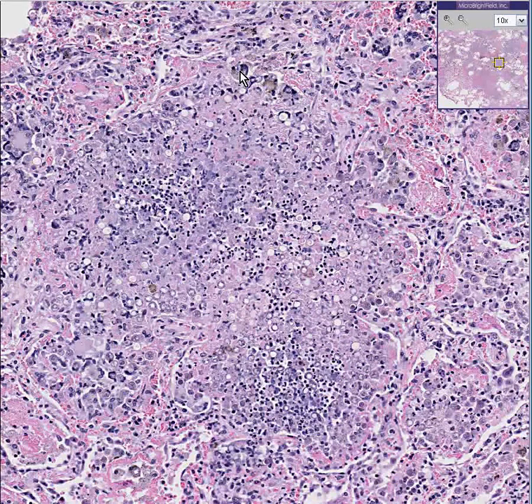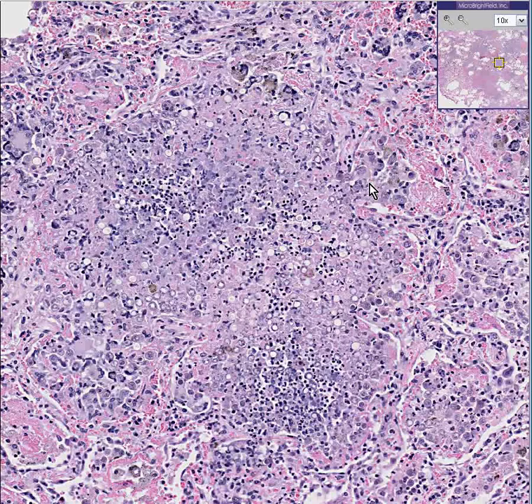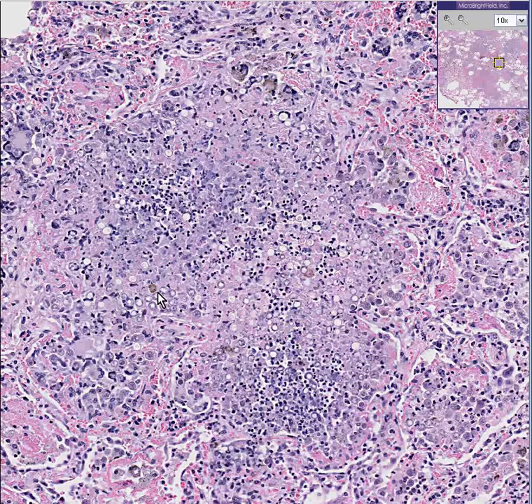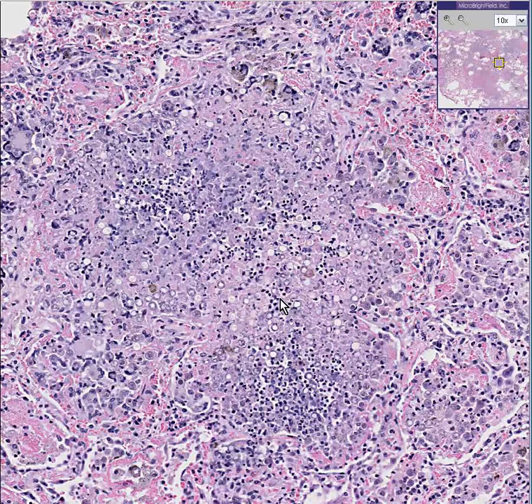You can see giant cells, multinucleated, kind of more at the periphery of this. And I think you'll agree that there are these little round spaces in the middle, and perhaps there are other inflammatory cells here like neutrophils and lymphocytes.